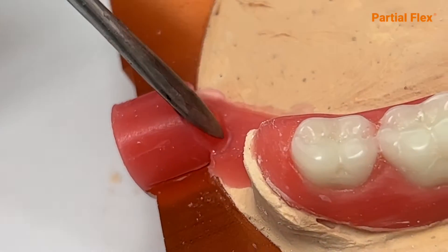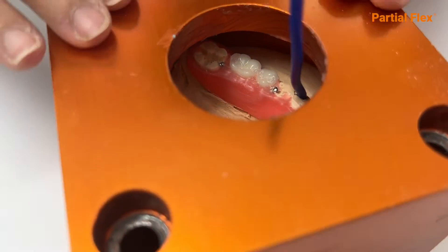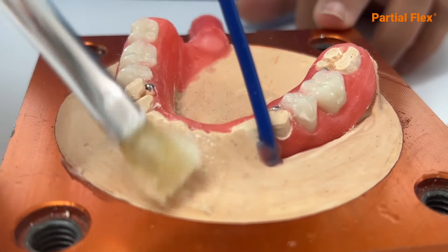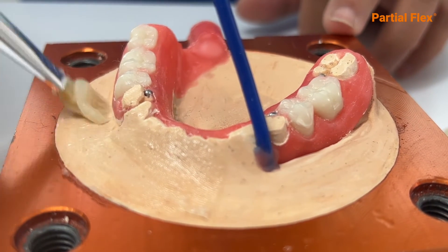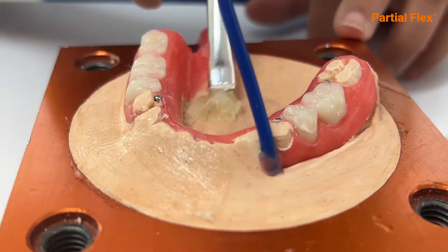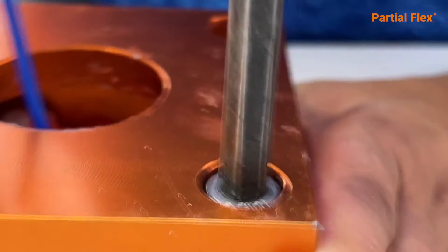Stop the entry point of the flask with a wax plug and seal. Close the flask to see if the chimney has the correct height. The chimney must protrude from the flask. When the plaster is hardened, apply petrolatum — make sure there is no contact with the wax. Clamp the flask together and fasten with two screws only.